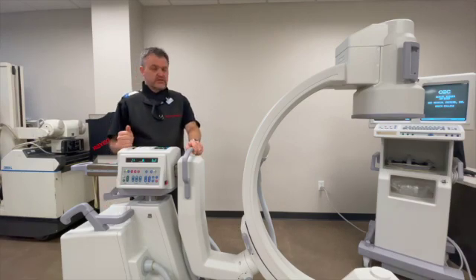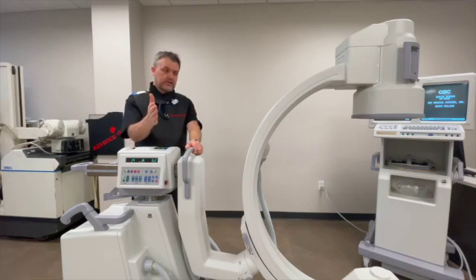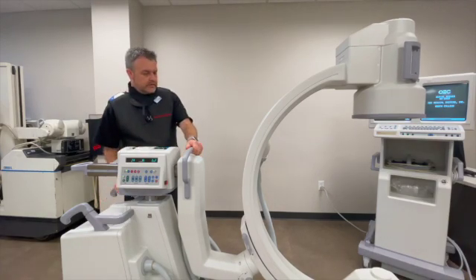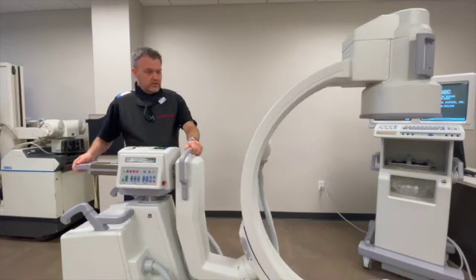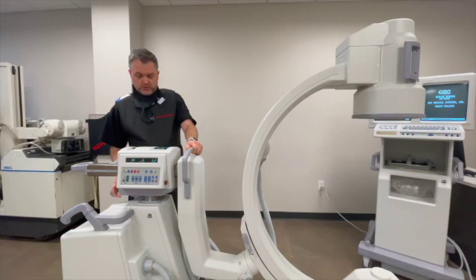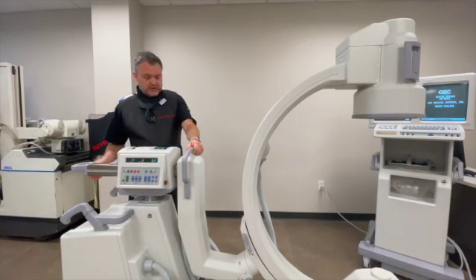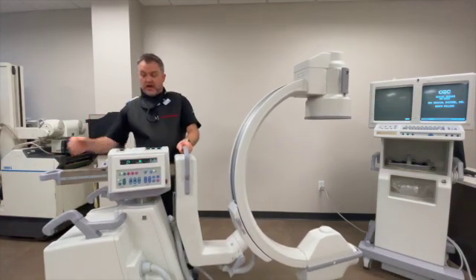The next lock is the WAG function. That allows your assembly to move or sweep 10 degrees to the left or 10 degrees to the right. For all of these locks, you want to ensure that your base is locked, so that only the intended direction of movement happens. If you try this with your base unlocked, when you unlock the WAG, you can actually pivot the entire machine.